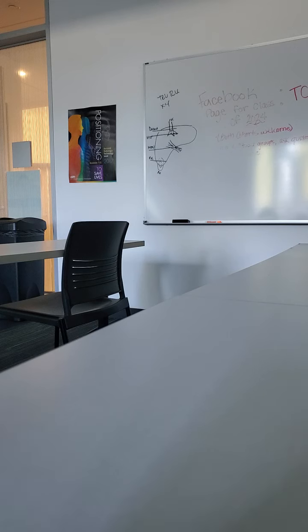And how about our transverse? Who's at the very top? Dome. MPV. Kidney land. Is that making sense? We're cutting this thing up in pieces.